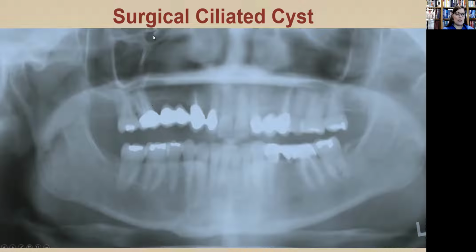And so here's a patient that has a history of maxillofacial trauma, and this is fairly remote, so this was years ago. You can see here a metal surgical tie. This is not as common nowadays. Now they usually use little titanium plates and screws, but we have a cyst here in the maxilla, and this cyst actually does not communicate directly with the sinus at this point in time. You can see that there is significant crown and bridge work.